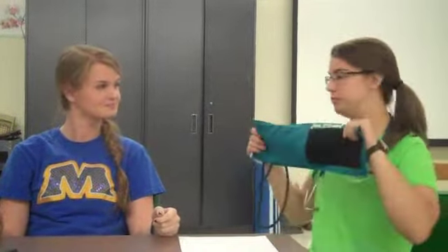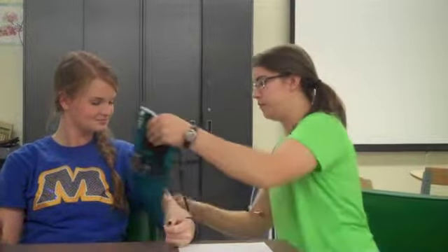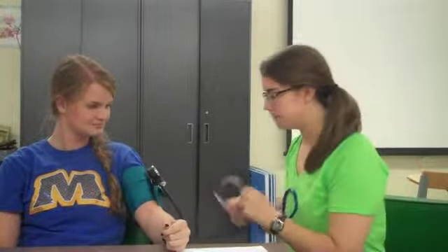Ashley, so today we're going to do a cycle ergometer test to test your VO2 max. What we're going to start off doing is taking your resting heart rate and blood pressure. Your legs have been flat on the floor, you've been resting for 5 minutes, and your arms have been rested at heart level. So I'm going to take your resting blood pressure. The blood pressure and heart rate will help us determine workloads for the cycle ergometer test.